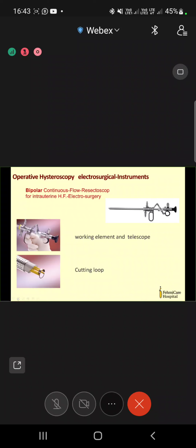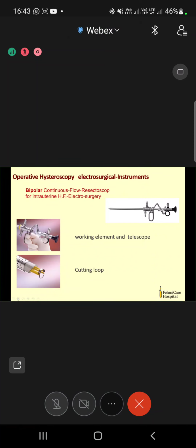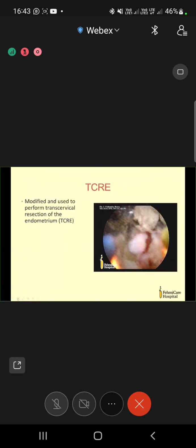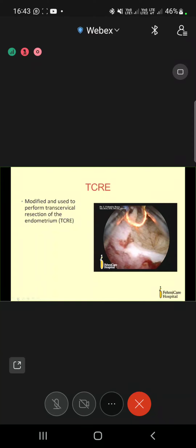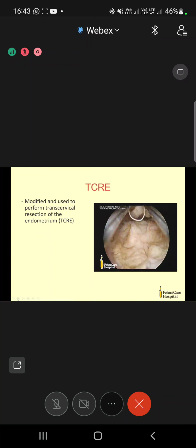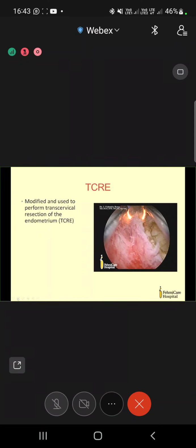And you should be a master to cut, and if you see a spurter in the same sitting, you should coagulate. So this is a procedure where we are resecting a submucous fibroid. The stroke should be from above downwards. You should resect bit by bit. It is a cutting mode we are using.